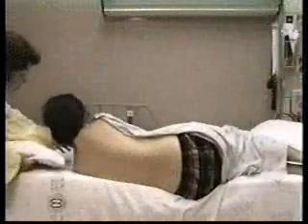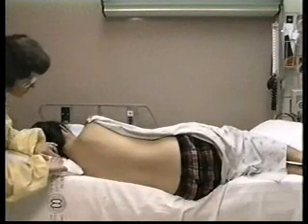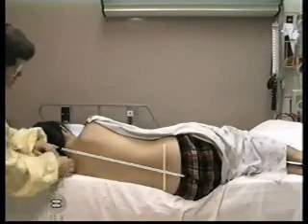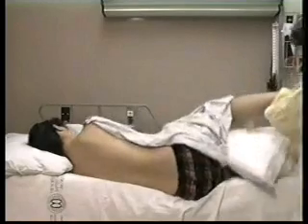Raise the bed as needed so that you are comfortable and can visualize your field. Make sure the light is adequate. Place your patient in the lateral decubitus position with the back close to the edge of the bed. The shoulders and iliac crests should be in perpendicular alignment to the spine. To help with this, put a pillow under the patient's head so that the external occipital protuberance and the spine are in the same horizontal plane. Flexion of the neck is not of great value here to heighten the interspace. Pillows can be placed between the knees to assist in keeping the iliac crests aligned.